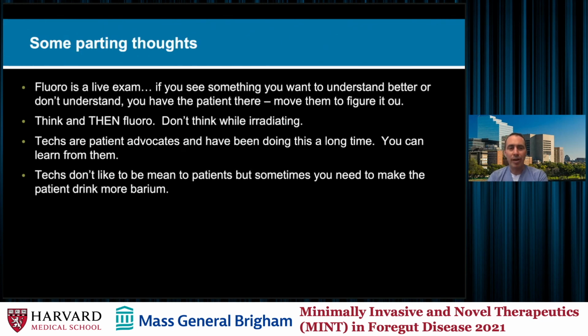And so, parting thoughts, right? Fluoro is live. That makes it fun. The thing I always tell my trainees is think and then fluoro. If you are thinking when your foot is on the pedal, that's not good. If you're not thinking at all, that's not good either. But you don't want to think when you're doing that; in cardiology you want to sometimes be careful.